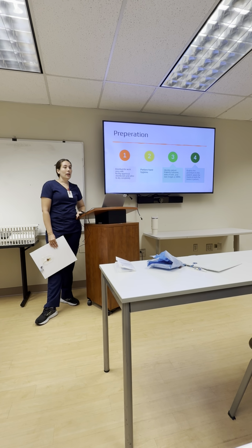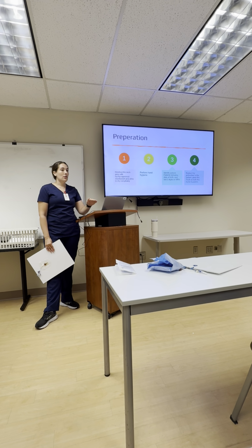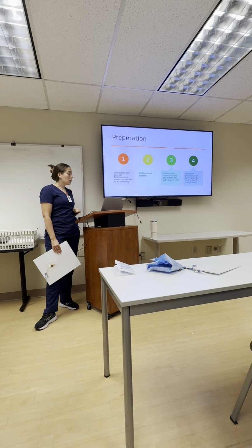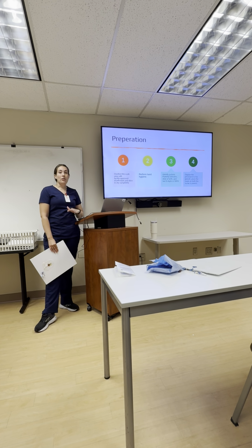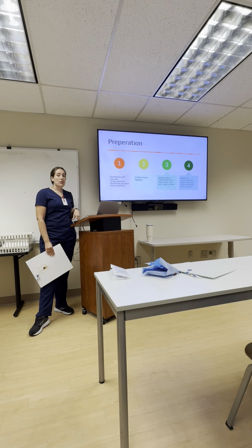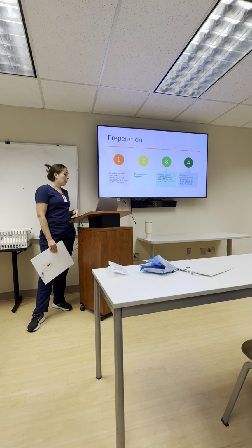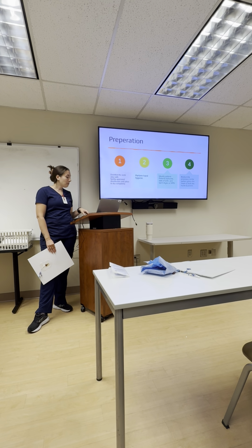So preparation, we're going to clean our area. We don't ever want to open sterile supplies on a dirty area. Just take some purple top wipes and scrub the area. While we're waiting for that to dry, you can perform your hand hygiene. And then we want to identify the patient using Hackensack's 3 methods of patient identification, which is their full name, date of birth, and the last 3 digits of their MRN.